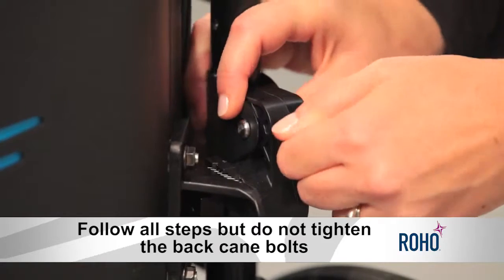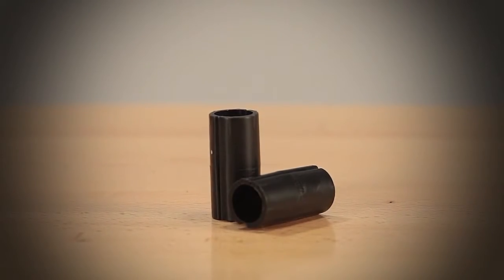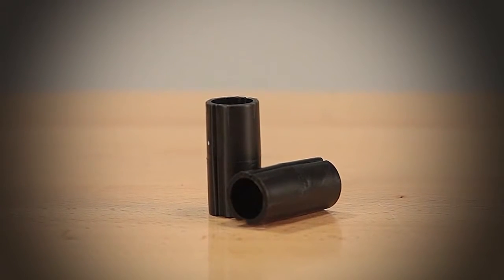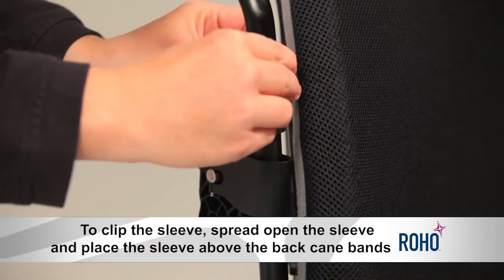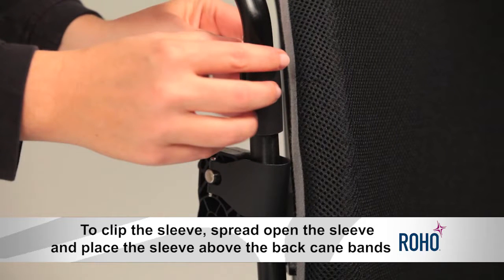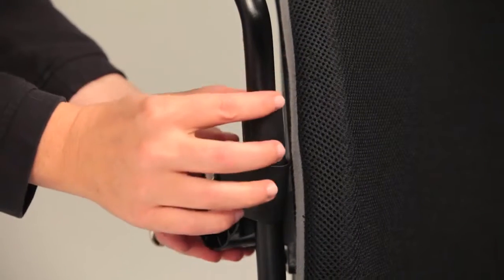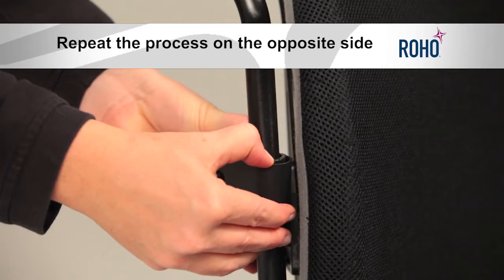We will demonstrate. Once you have the back cane bands attached, clip a sleeve onto each wheelchair back cane. To clip the sleeve, spread open the sleeve and place the sleeve above the back cane bands. With the back cane band loosened but still attached, slide the sleeve down inside the band. Repeat on the other wheelchair cane.